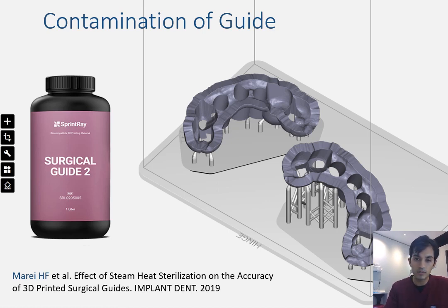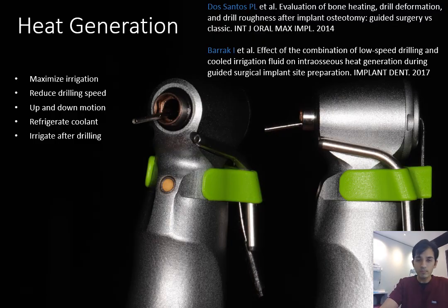In the rare instance where I may drop this or it gets contaminated during a surgery, I have a separately wrapped and packed autoclaved guide that can be used to finish off the case without reverting to a free approach. The final myth here, heat generation.